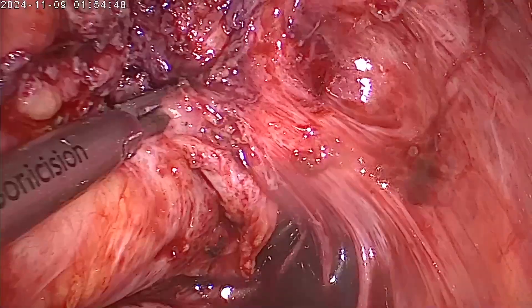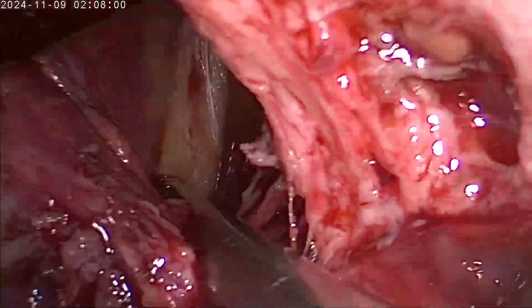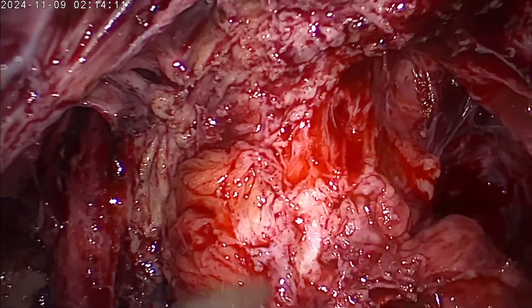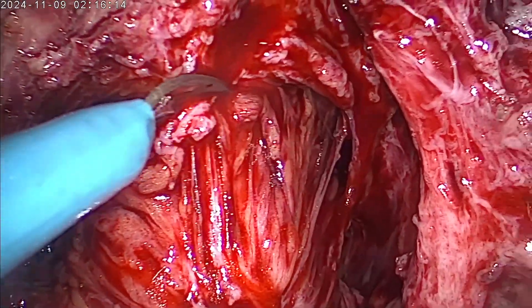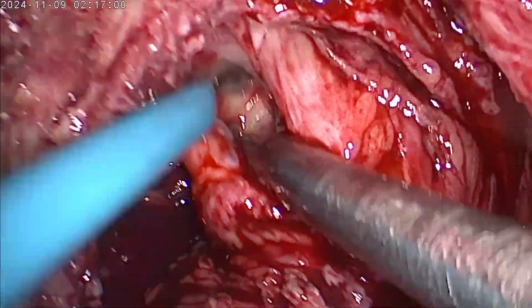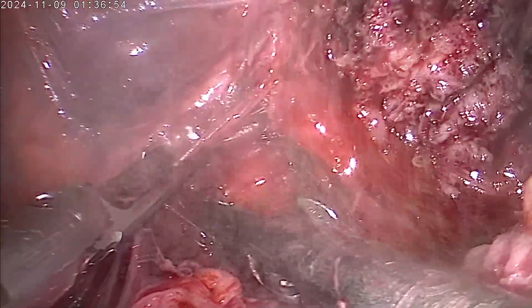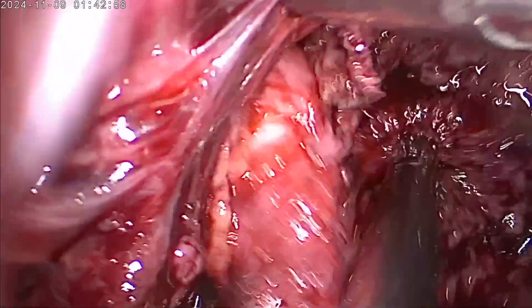We remove the nodule from the uterine end on the left side of the rectum and now we finally come to the central dissection. In this step, you will notice that we are using a bowel probe to help us with the dissection. The entrapment over the ureter is removed, and for this particular patient, we will be checking the IVP after three months and reassessing the left ureter.